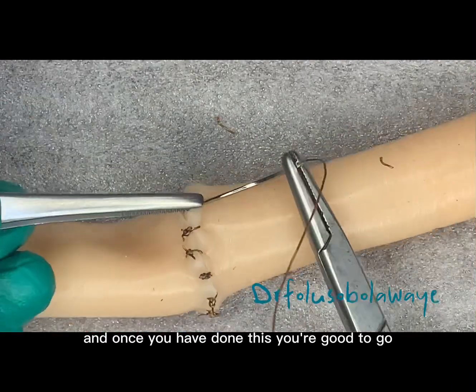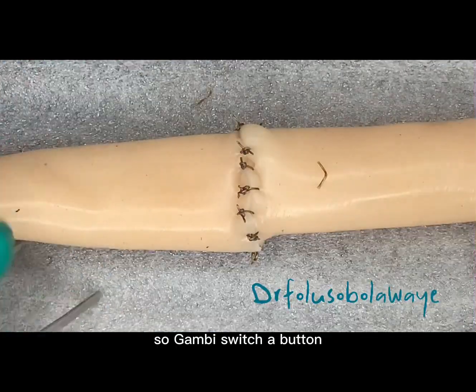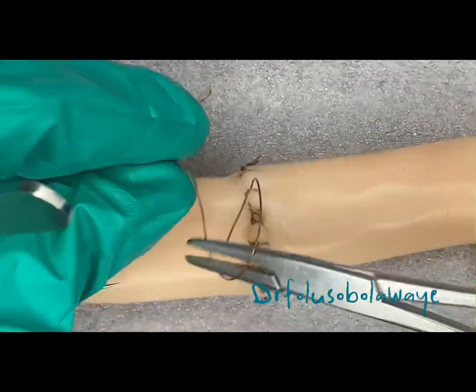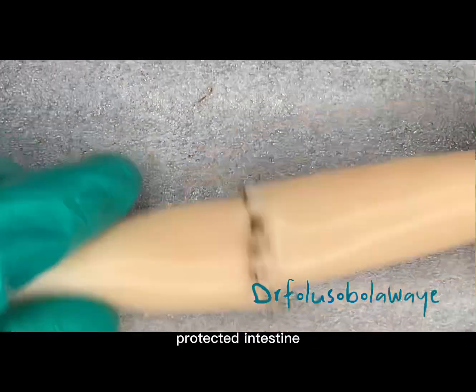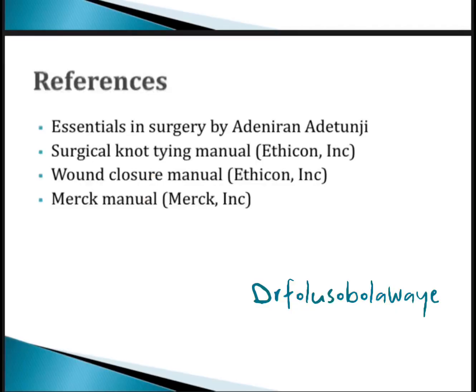This is what you do until you exhaust the entire resected intestine they are trying to oppose. The Gambee suture pattern is specifically designed to oppose resected intestine — they call it anastomosis of intestine. Try and practice this, and have a beautiful week.